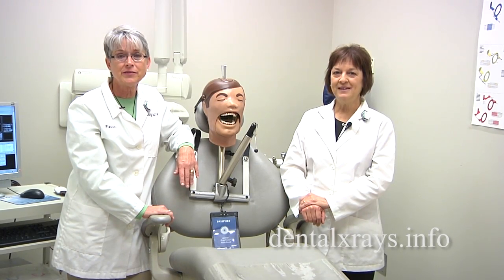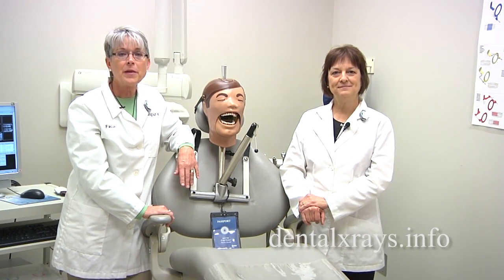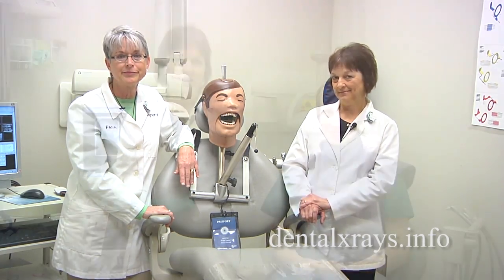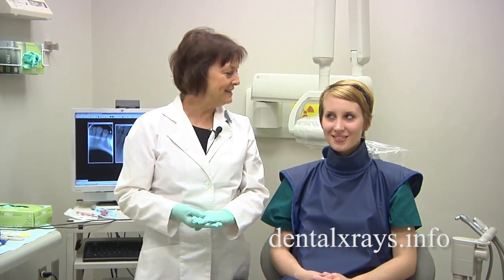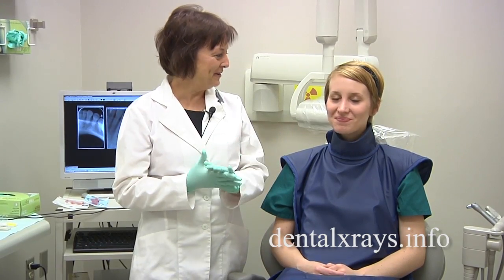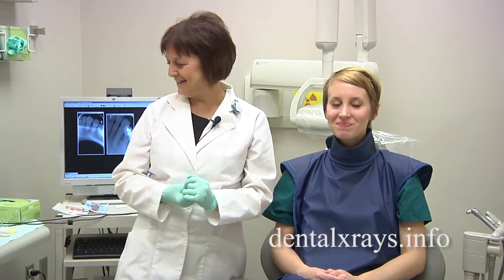Hi, I'm Sherry Ortiz and I'm Vicki Romans from Ask the Experts on dentalxrays.info. I'm going to show you a few techniques that you can use when you're doing the anterior PAs of a narrow mouth. If you have the perfect ideal patient, you usually don't run into any problems. It's when you have difficult patients — whether they have a narrow or shallow palate — that's where you have to do a little bit more creative x-raying.